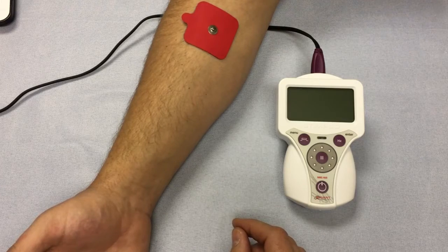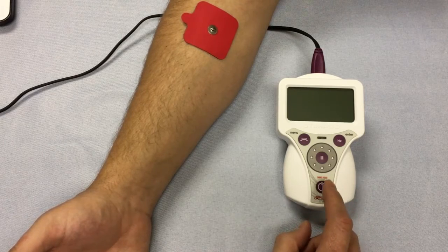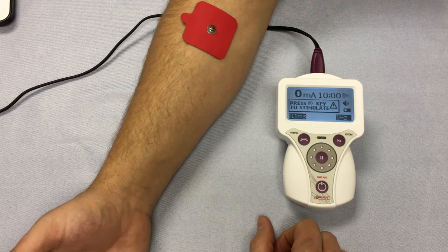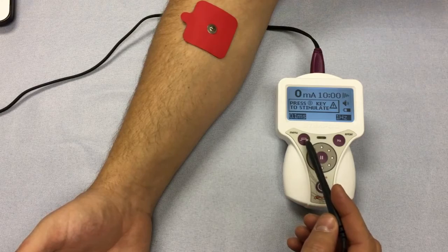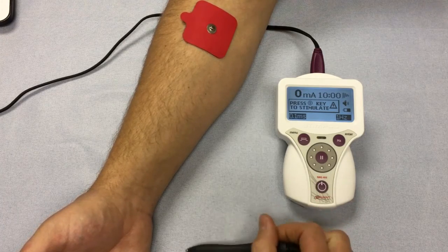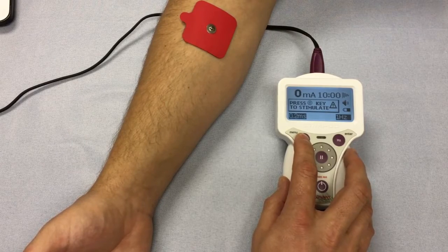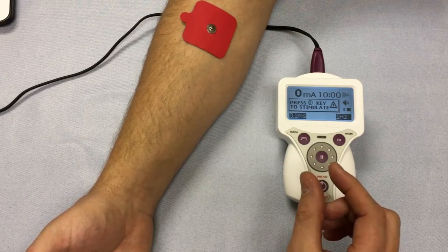Let's start with setting up your device. Once you've identified the treatment area, using the Stimpod is extremely simple. The first step is to switch the device on. Secondly, we look at the pulse width — displayed on screen with its corresponding button showing the pulse width symbol. You have two options: 0.1 ms and 2 ms. We recommend starting at 0.1 ms, as this is the least amount of energy you can transfer to your patient regarding pulse width.